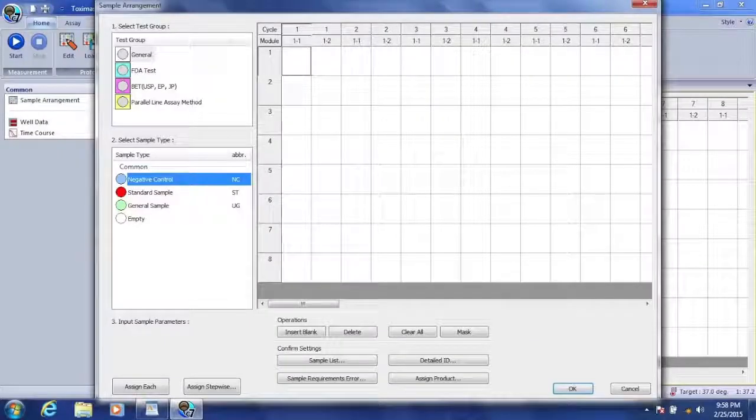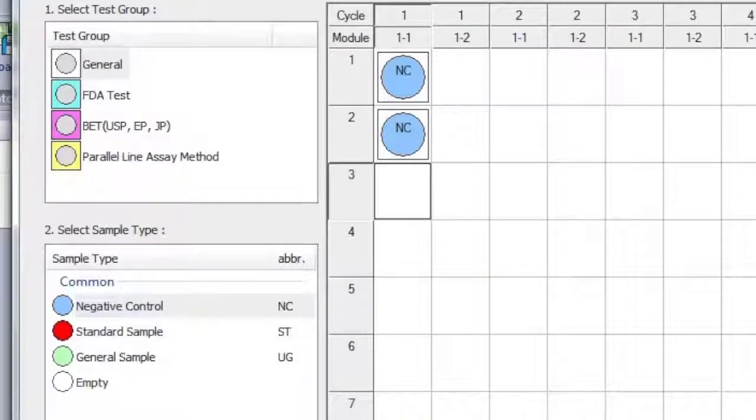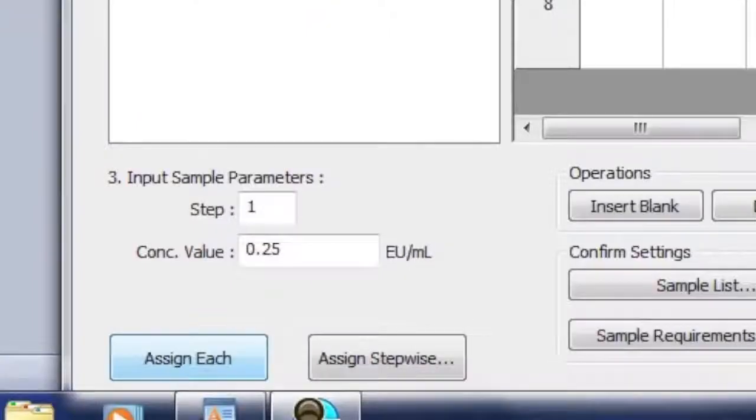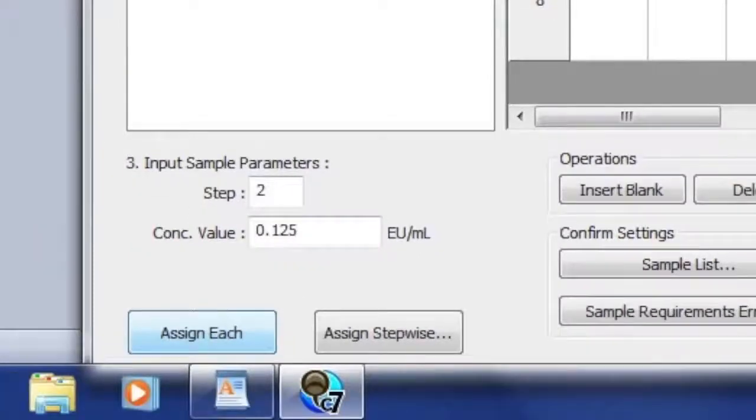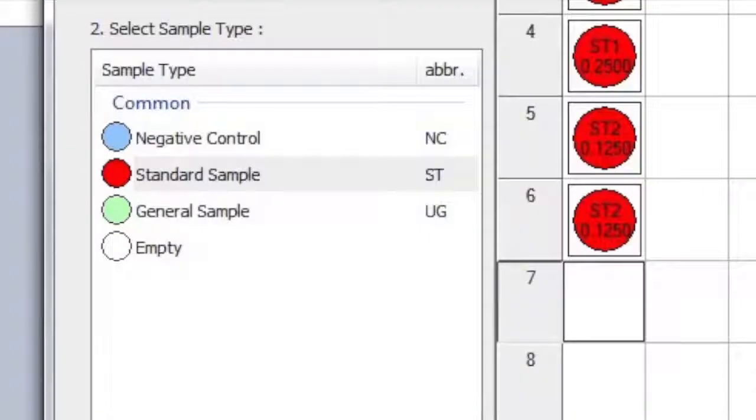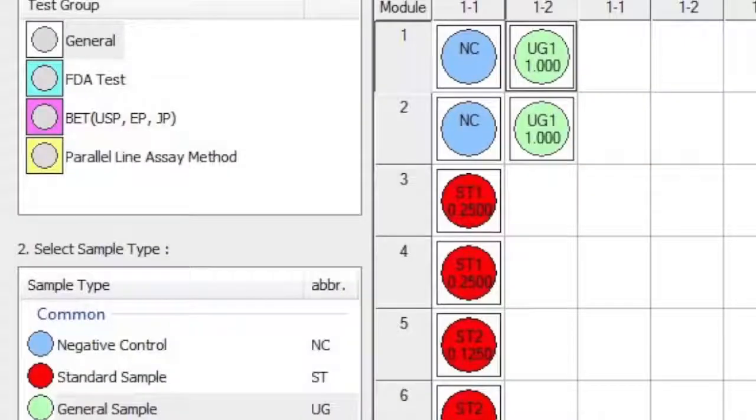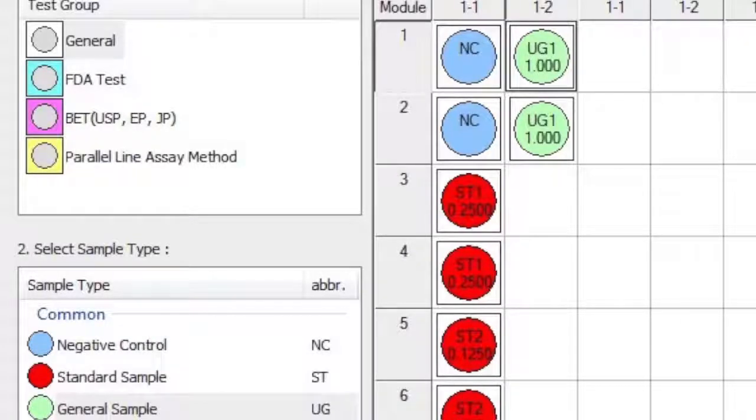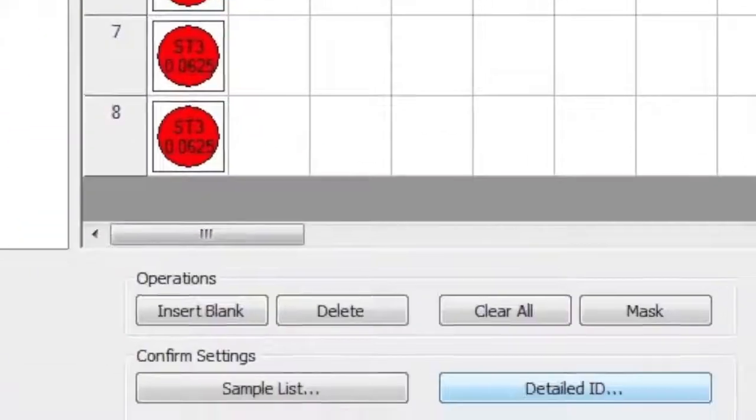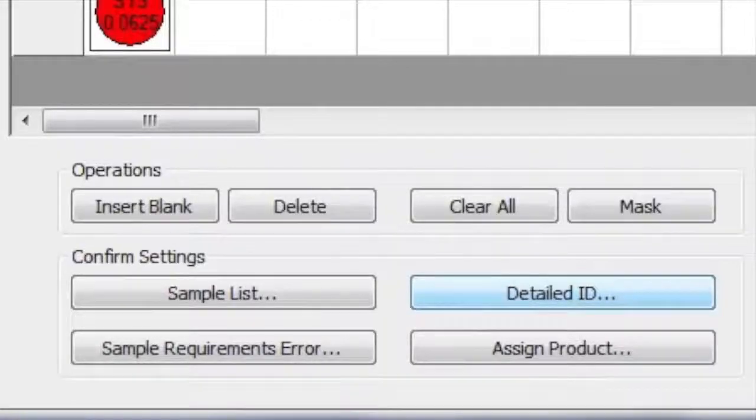We will now add the Negative Control to the Sample Arrangement in positions 1 and 2. We will now add our Standards to our Sample Arrangement. Prior to adding our Sample Arrangement, we can enter the parameters of the sample. We'll repeat such steps for two other concentrations of our Standard. This will support the Standard curve generating within the Toxamaster program. Finally, we arrange our General Sample.